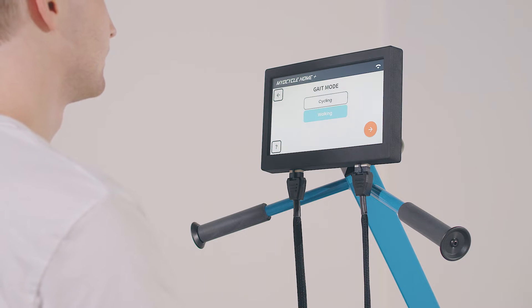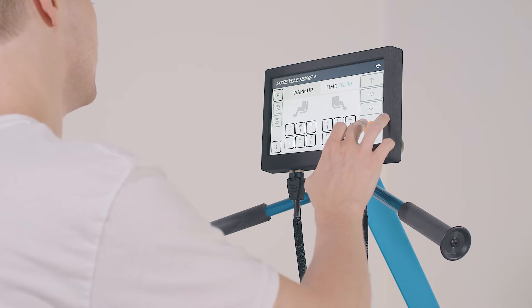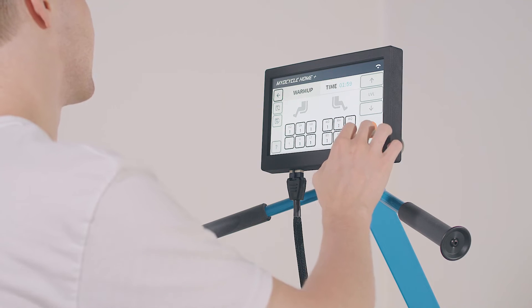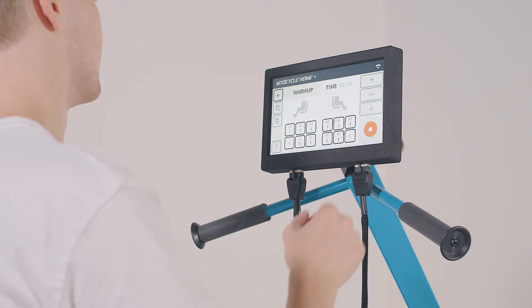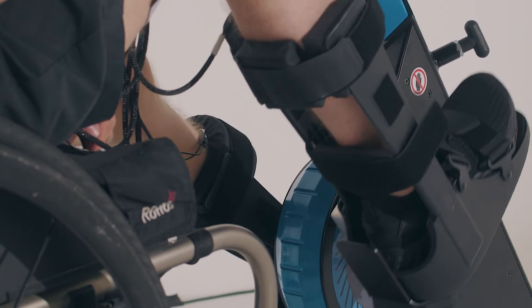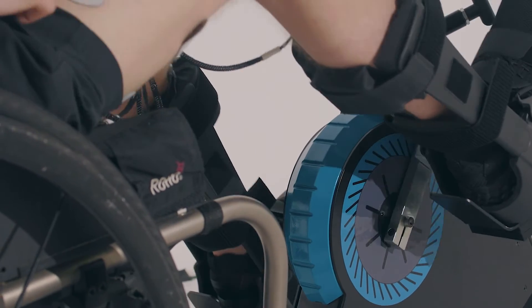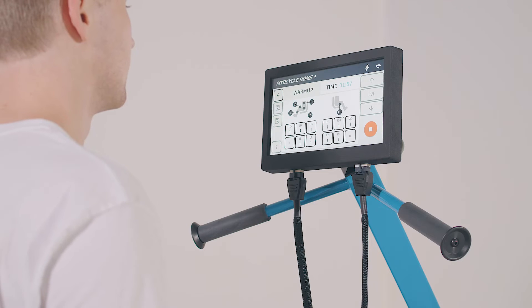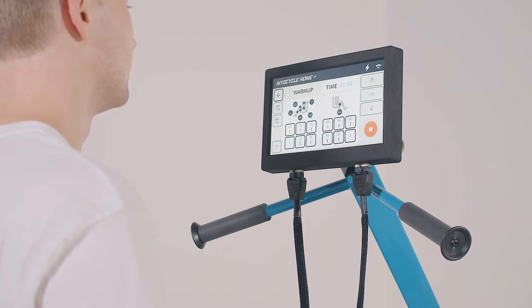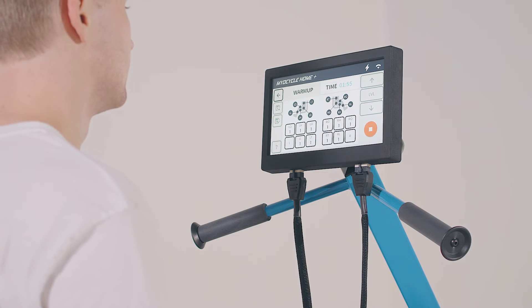Once you're ready to start your session, press start to begin the two-minute warm-up. Relax and let the motor pedal for you and verify that the muscles you have connected light up on the screen. When the warm-up ends, the workout begins.